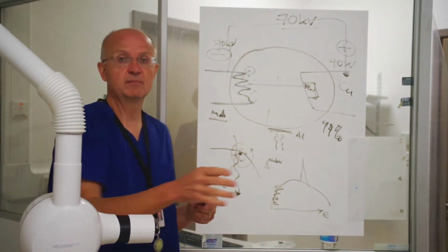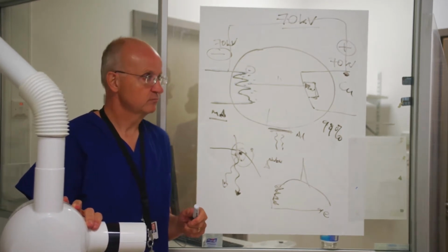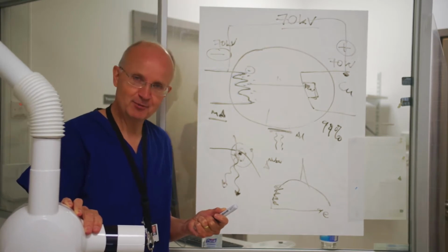As Sarah has already mentioned, we prefer to use 70 because it reduces the patient dose significantly. Doesn't the IRMER regulations state that we should be using 70? The IRMER regulations state that we should be using 70, as Sarah has rightly pointed out.